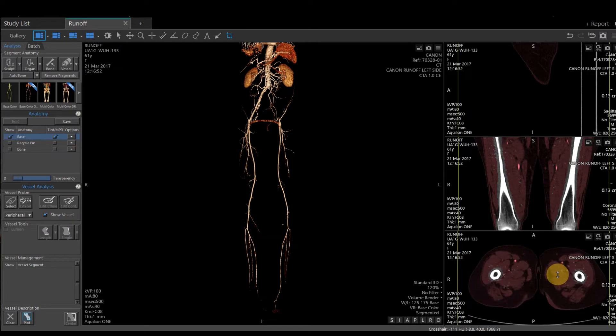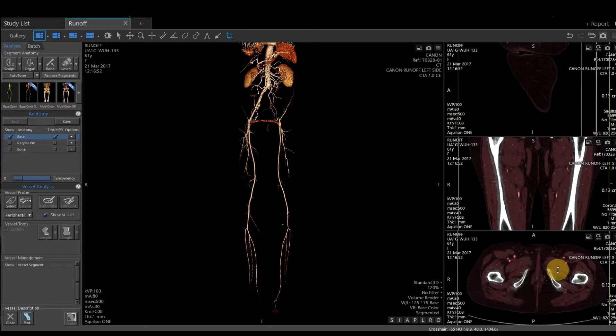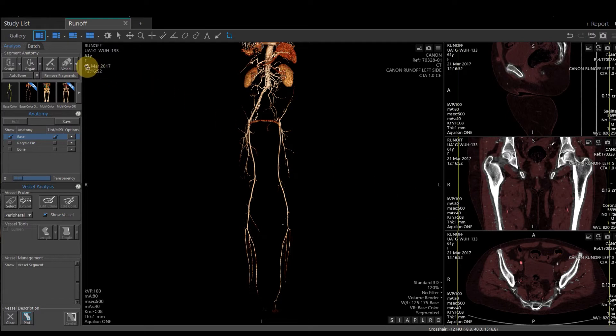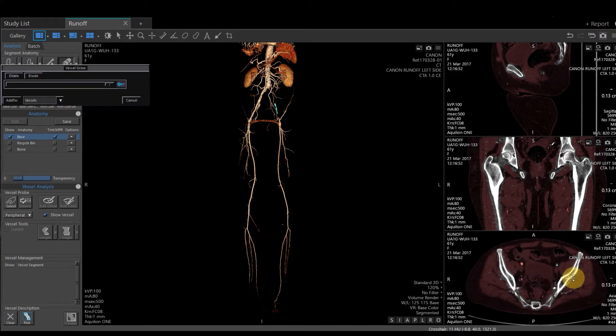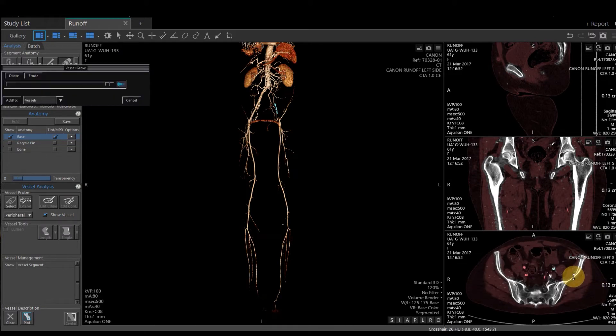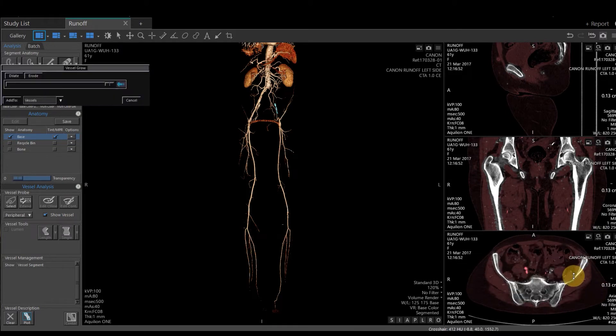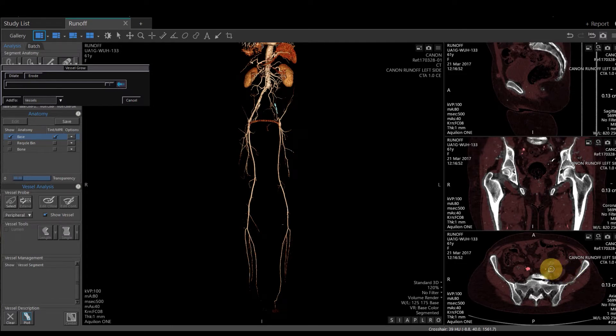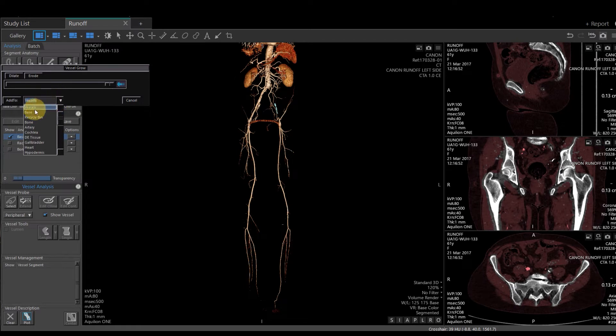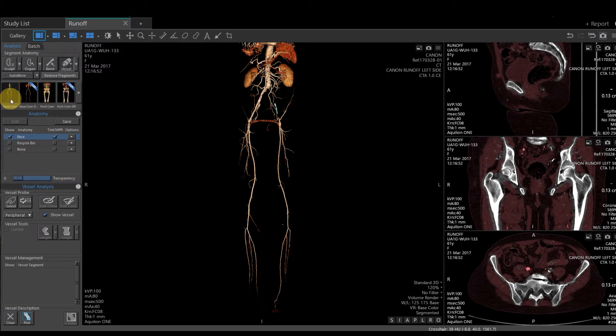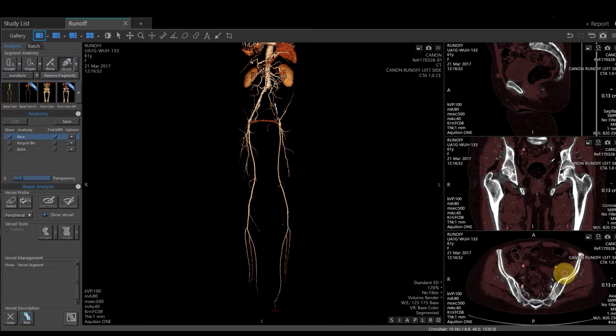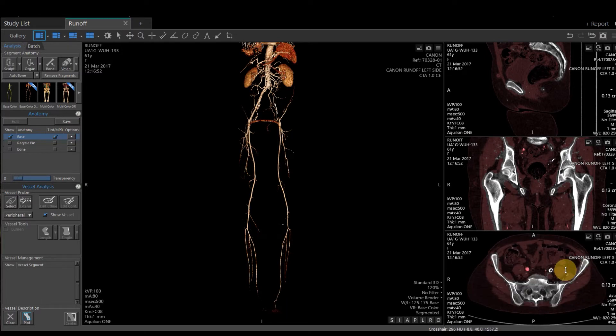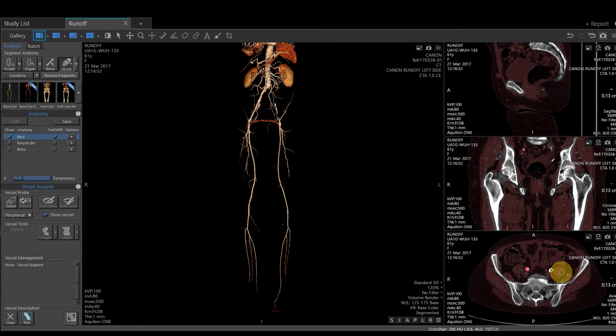If I was missing a specific segment, you can use your Grow tool, which is the vessel icon. Left click and hold down, and that is going to grow in that specific segment. If I want to add that, instead of adding it to a vessel file, I want to add that back to the base file. That's going to add that, and once I do that, it turns that specific area the reddish pink color. That is just another way of going through and checking to make sure you have all the vessels necessary.